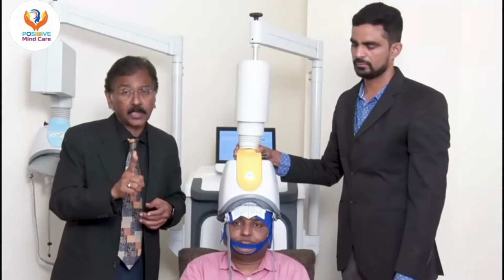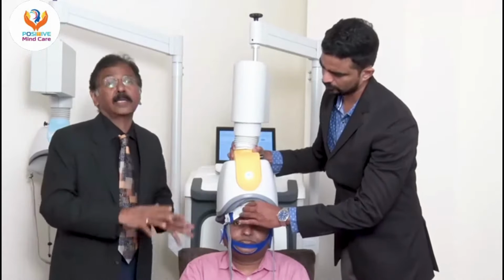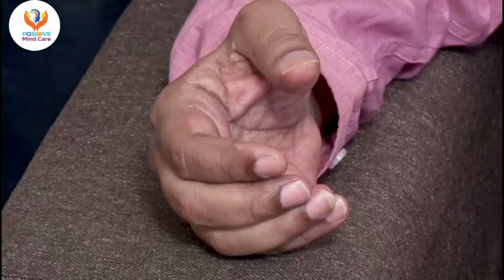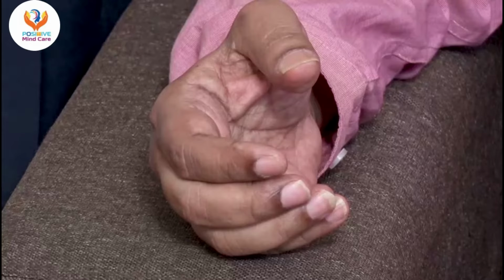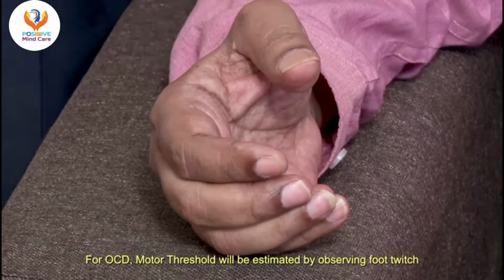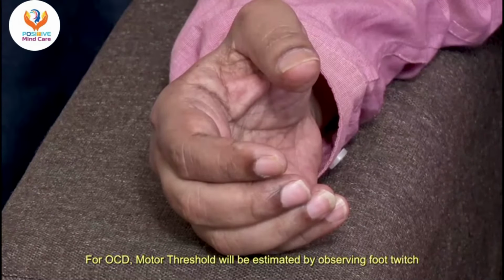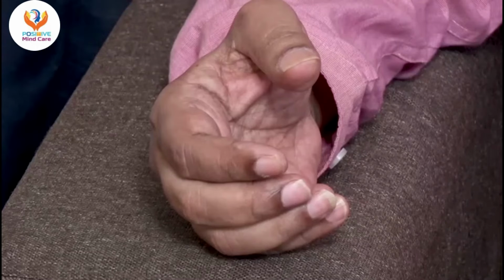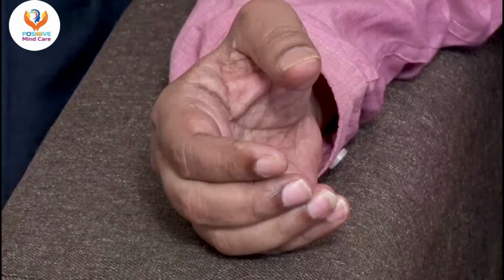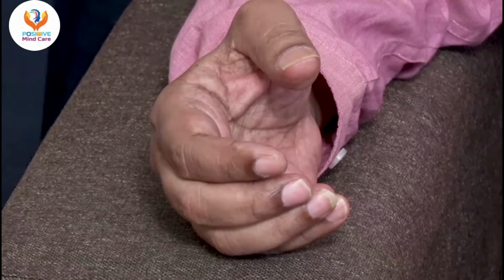The most important thing, motor threshold, is we will know what intensity of magnetic field we have to administer to this particular patient. Now you see what I have told you, when we apply a single stimulus, you are seeing the twitch on the right thumb. That means the helmet is placed in such a way that when we apply the stimulus, it stimulates the motor area of this particular person, and that is where we are getting the twitch. Based on this, we will judge what intensity he has to get and then proceed for the treatment.